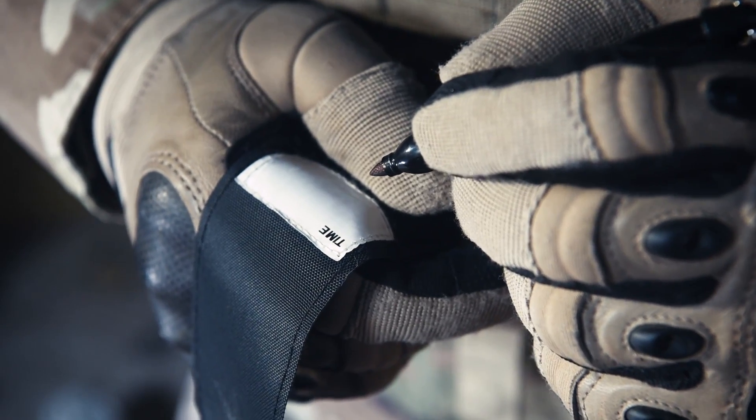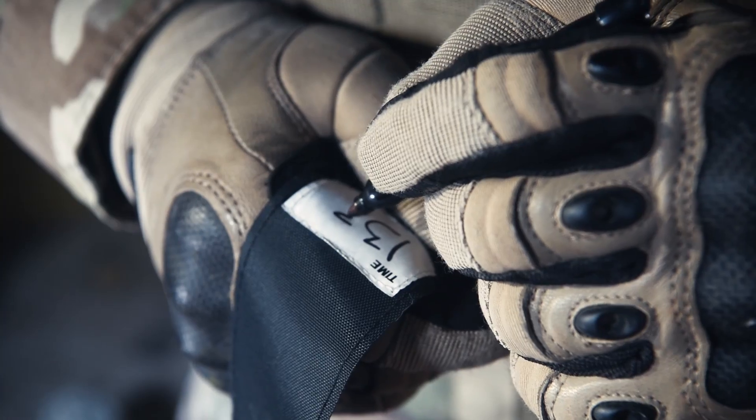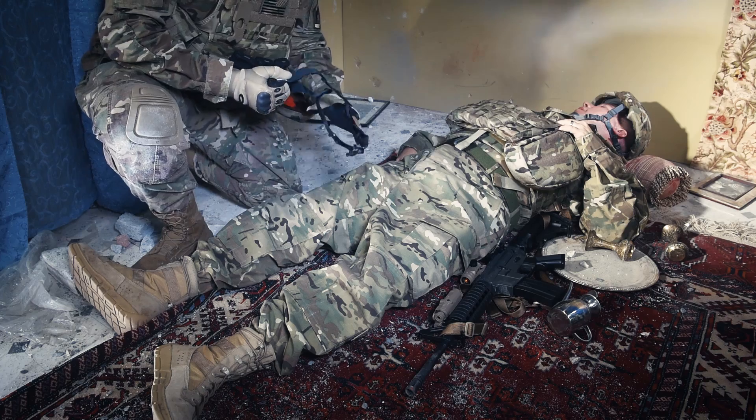Secure the excess strap with the Velcro tail. Depending on the tactical situation, write the time of day on the TMT and reassess all wound treatments and prepare the casualty for evacuation. Watch this TMT buddy aid demonstration.